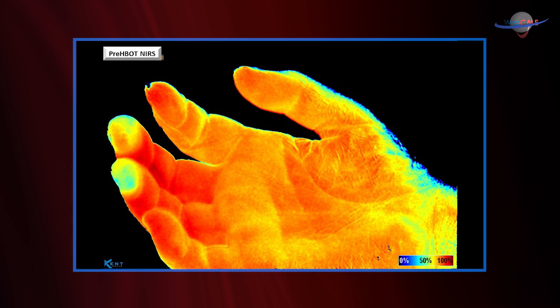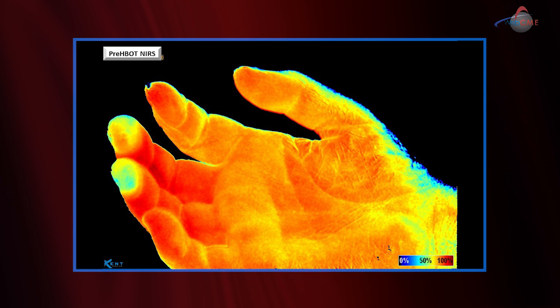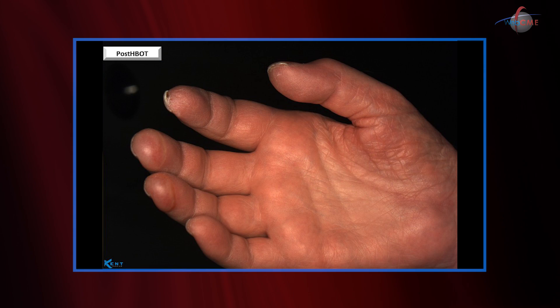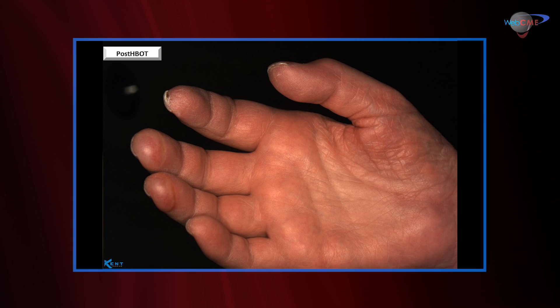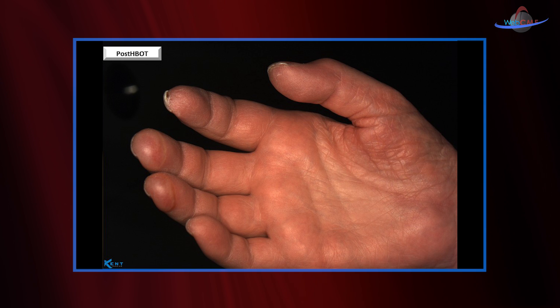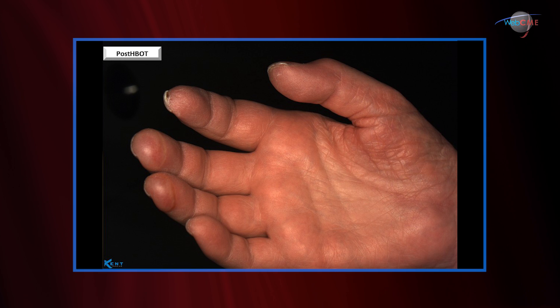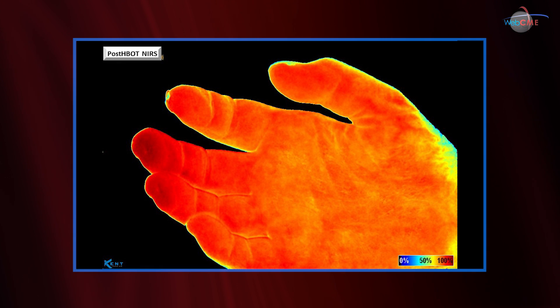The next image shows the same positioning of the hand with near-infrared spectroscopy, and again you notice the dusky changes on the middle and ring finger. Following hyperbaric therapy, we have very impressive resolution of those dusky changes, suggesting a good clinical outcome. But does that correlate well with increased oxygenation of the tissues and perfusion?